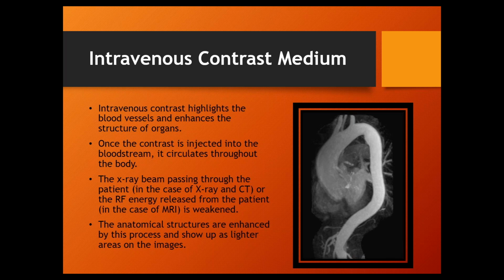MR and CT injectors is just done with an IV. So basically we're just kind of flooding the whole patient, not 100%, but that's the gist. We're flooding the patient's bloodstream with contrast so we can see it everywhere. It's not 100% true, but it's generally true for this class.